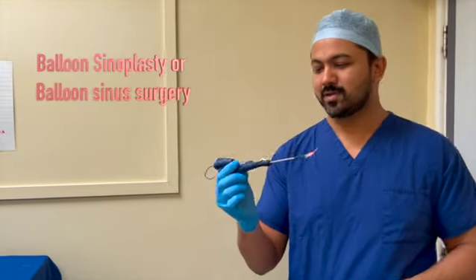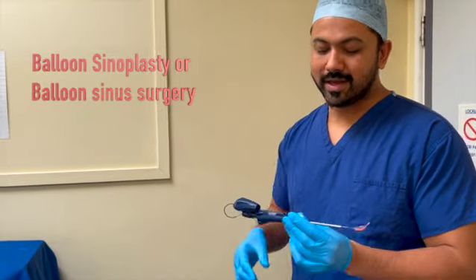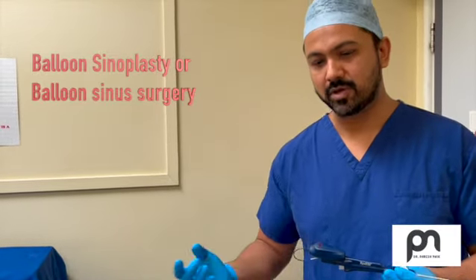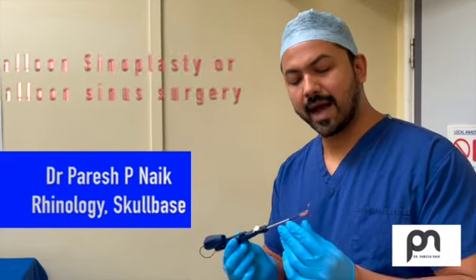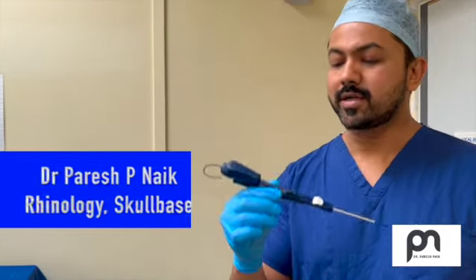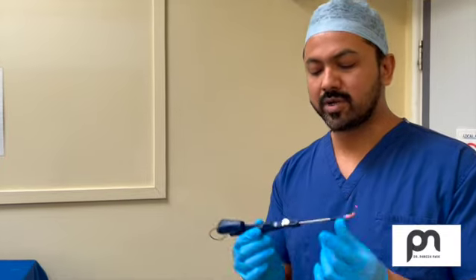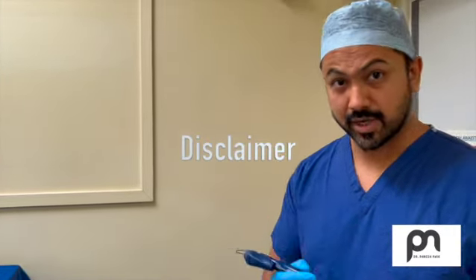Hi, so today we are going to look at balloon dilation. Balloon dilation has become really popular over the past few years. It's a minimally invasive surgery for your sinuses and also for the eustachian tube. This is a Stryker Express balloon dilation. Just as a disclaimer, I don't get paid by Stryker, I'm not promoting it.